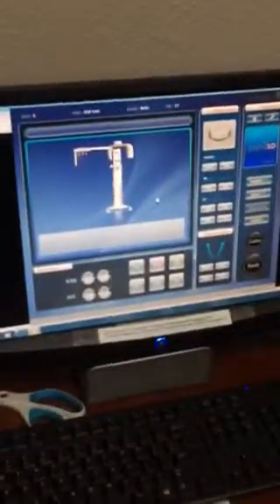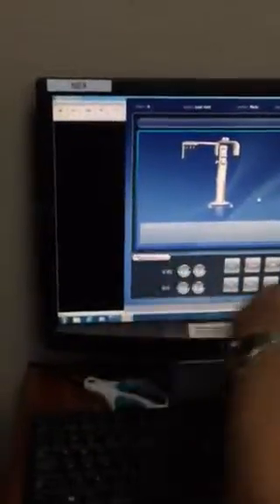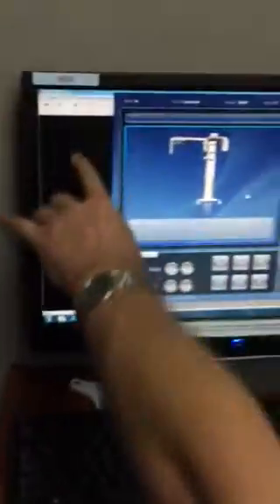So the main point here is wait for that to stop making the R2-D2 noises, 15 seconds or so, until you try and activate the capture software. If it's not powered on, you'd get some kind of an error message. If there's no patient open, you'll get an error message.